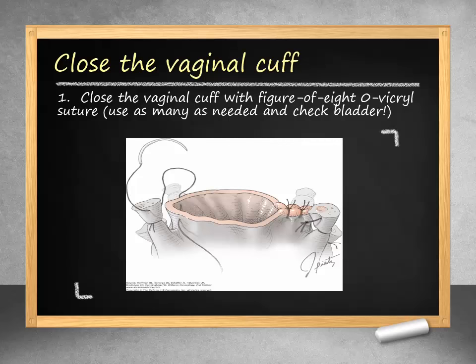We will now close the vaginal cuff. This should be done with multiple figure-of-eight sutures with Vicryl suture. Take care to avoid the bladder while suturing.